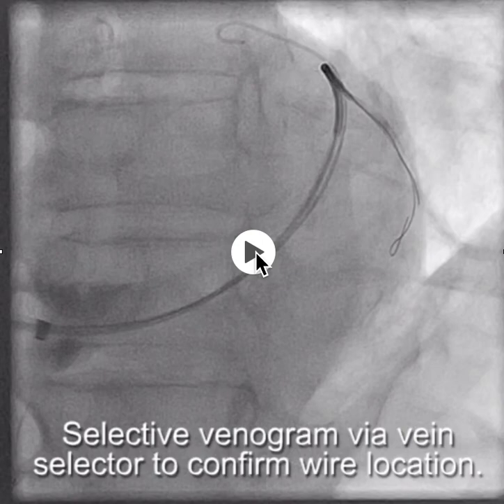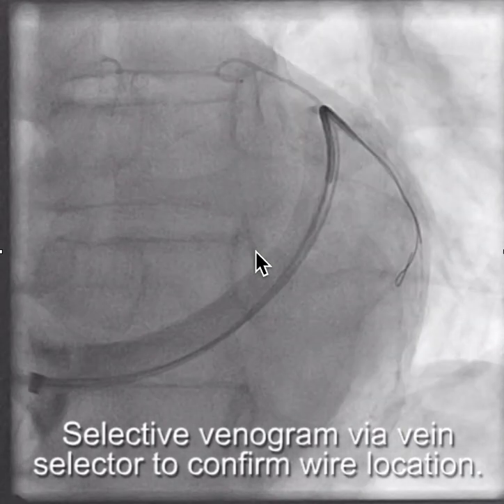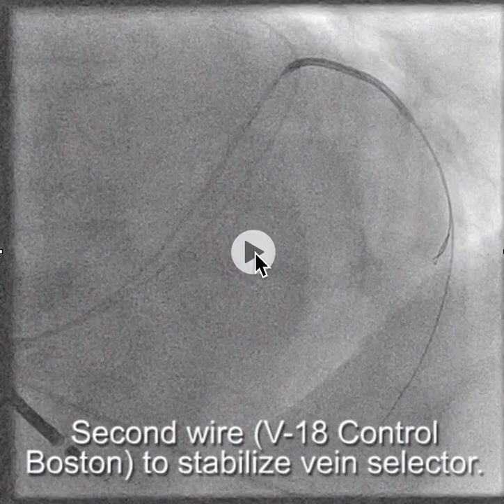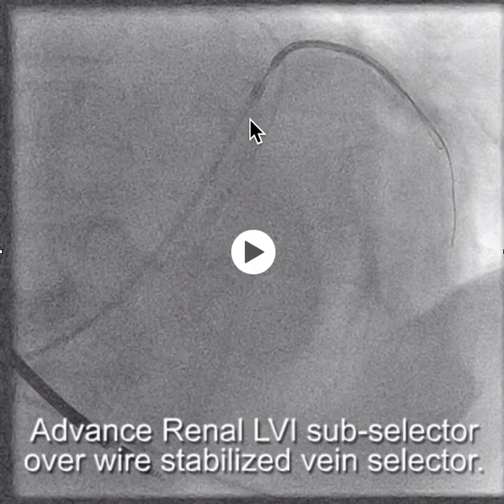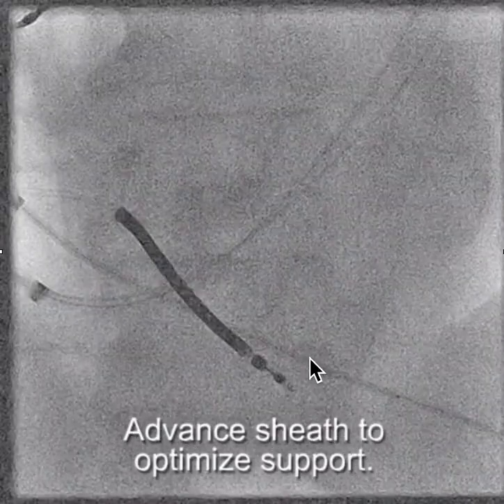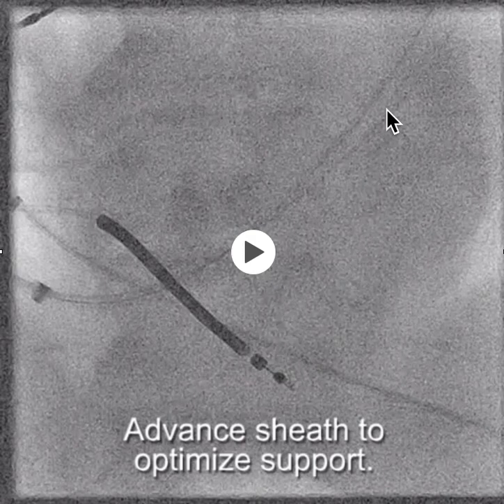So we're going to put in a second wire — the V18 control wire, which is really nice and stable. The V18 control wire, as I've said before, makes the Ironman seem like a wet noodle. We advance the V18 control wire and that gives us support for the vein selector. Then over the vein selector, we can advance the renal subselector. The wire-stabilized vein selector provides the rail over which to advance the subselector.